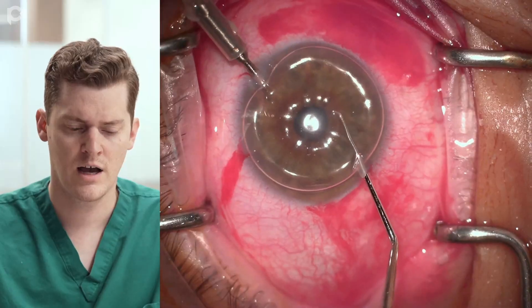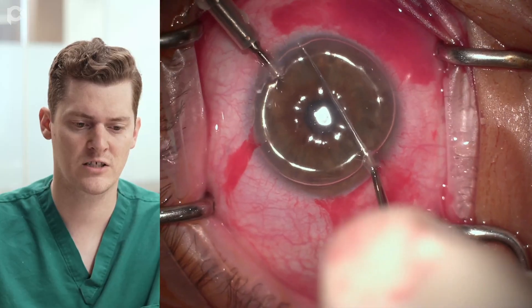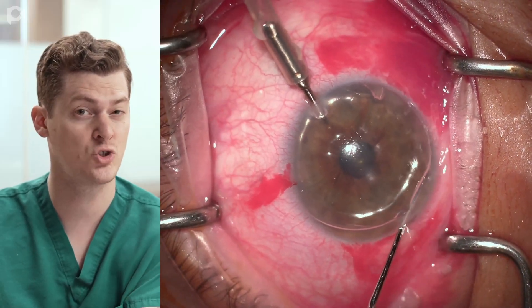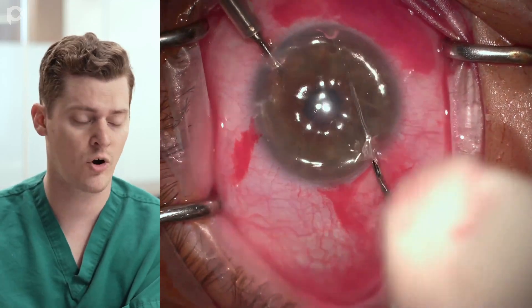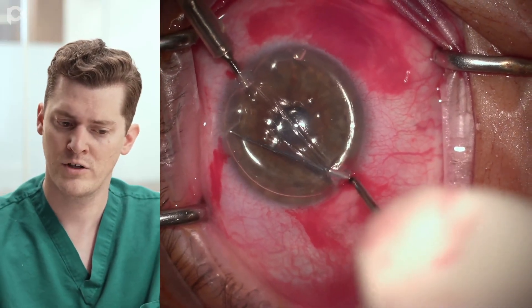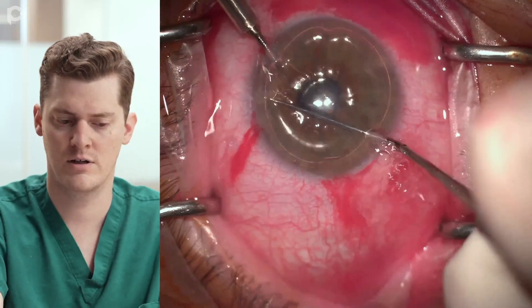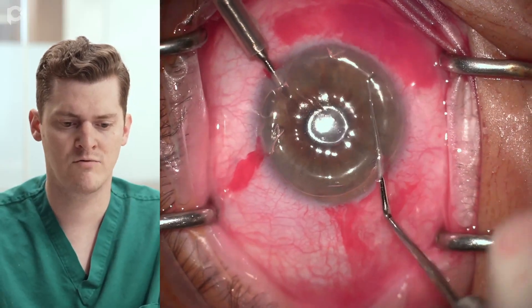After filling the eye with air, I'm putting the reverse Sinski hook in. I've learned several tips about the descemetorhexis to make things smoother. The first is engaging and staying in the very far periphery — I get way out near the limbus, but I don't want to engage in the angle because that can cause bleeding. If you're too far centrally from the limbus, you'll have peripheral fragments to deal with later. When scoring, you want it to be very gentle — just tracing the area in as uniform a motion as possible.